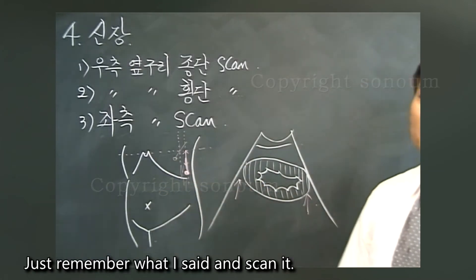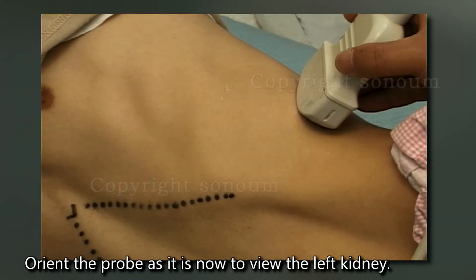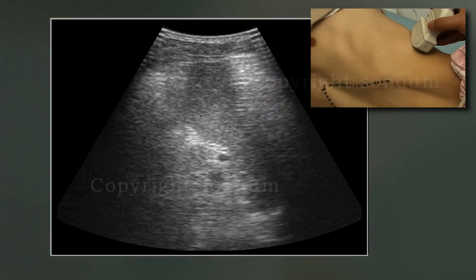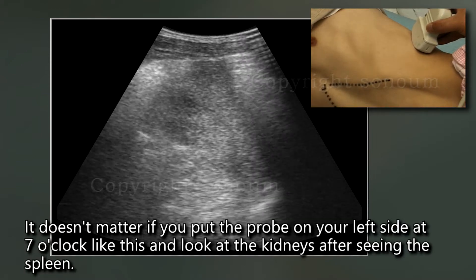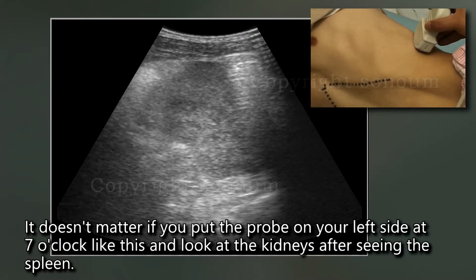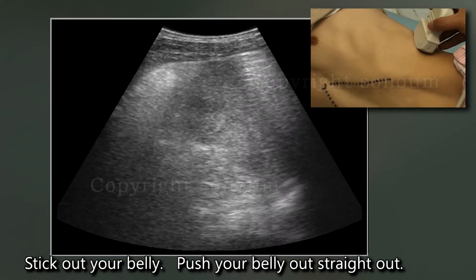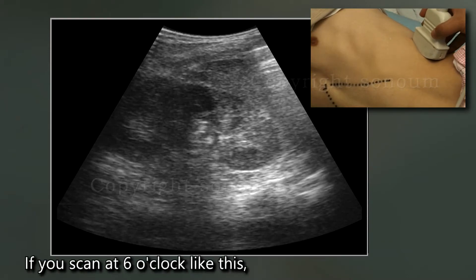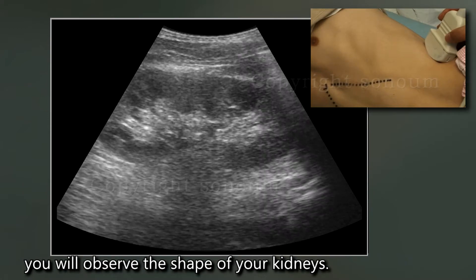Orient the probe to view the left kidney. It doesn't matter if you put the probe on your left side at 7 o'clock like this and look at the kidneys after seeing the spleen. Stick out your belly straight out. If you scan at 6 o'clock like this, you will observe the shape of your kidneys.